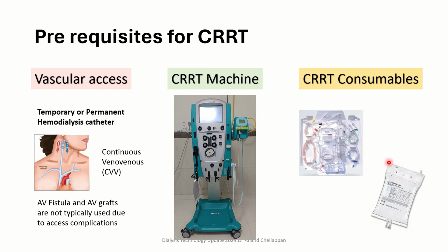In a typical hemodialysis or slow low efficiency dialysis, an RO water plant is required, the RO water supply is required to generate dialysate, whereas in CRRT, dialysate replacement fluids are used in the machine and it can be performed bedside, making it useful for critically ill patients.